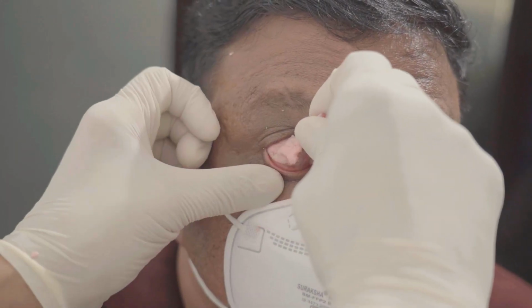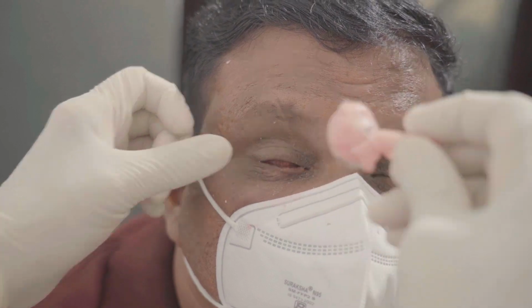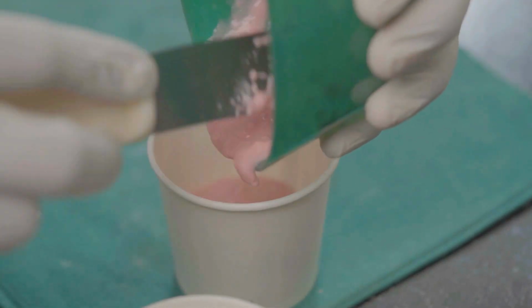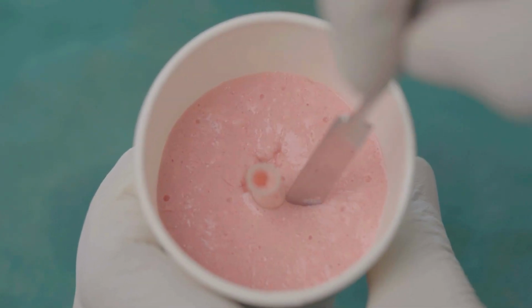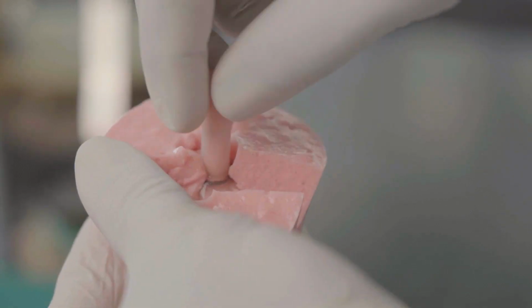Once this alginate is set, the impression tray is gently removed from the eyes. A plastic tumbler is half filled with water and alginate is taken and made into a paste. The impression tray is immersed into this paste and allowed to set. Once it is set, the contents are taken out as two halves and the tray is removed.